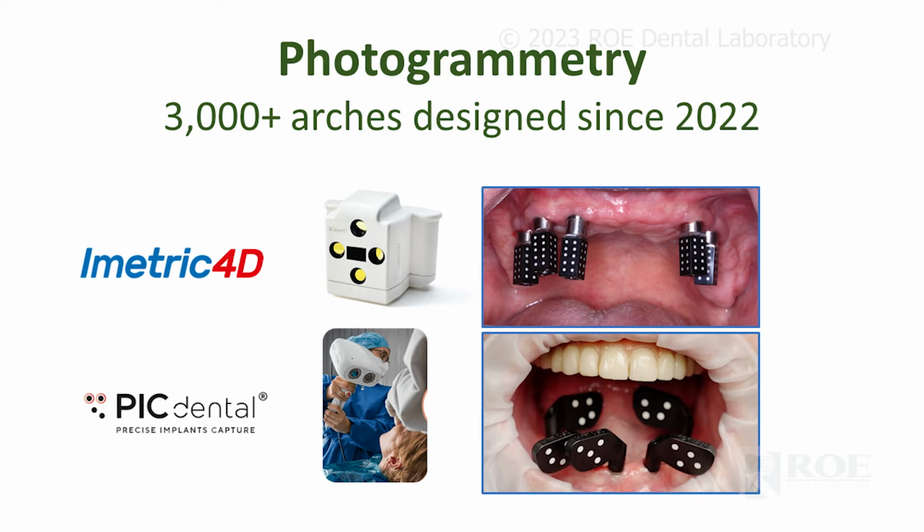Until recently, the only way to make a perfect model, a virtual model, was to take a physical model and put it in a lab scanner, right? And then photogrammetry came along a number of years ago, and the laboratory industry helped it become a product, which is scanning these dominoes in the mouth, and then you have a digital representation of the implant, well, the multi-unit abutment positions and implant in some instances. But really it puts the multi-unit abutment in space, and then the laboratory or specific software ties it back to the patient, right?